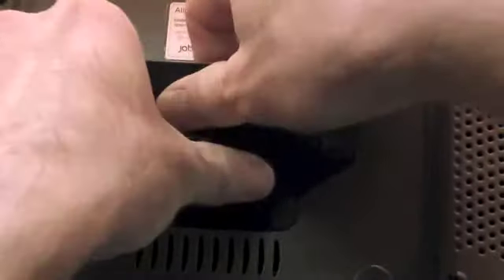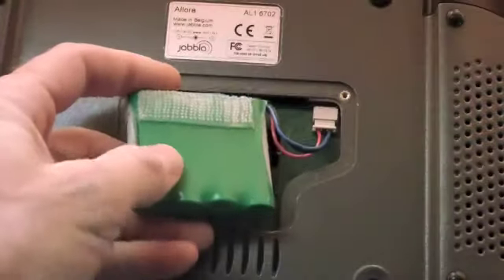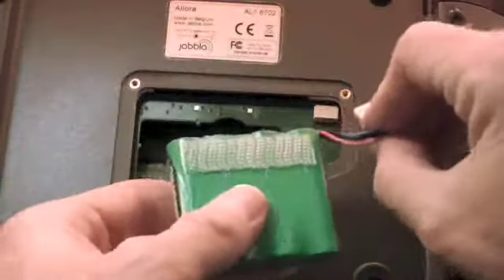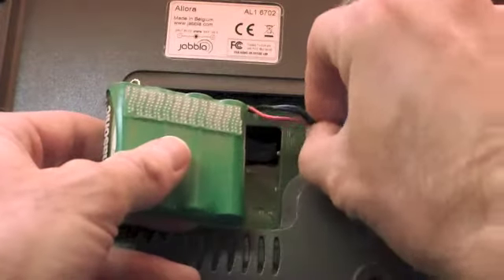Remove the battery cover from the bottom enclosure. The battery is attached to the battery cover with Velcro. Remove the battery cable from the battery connector. Insert the new battery cable in the connector on the device.